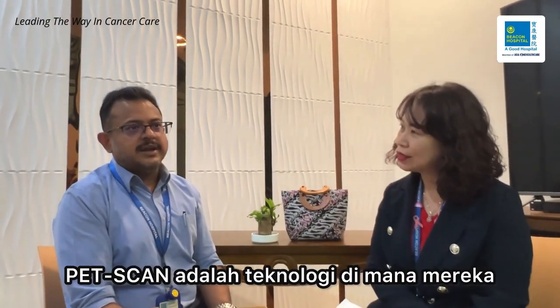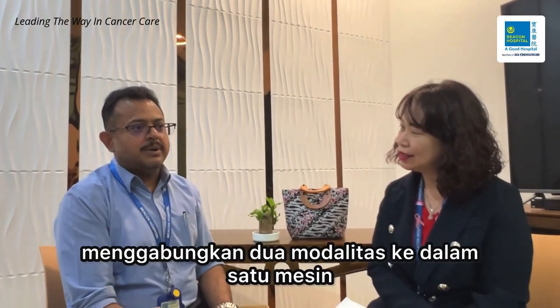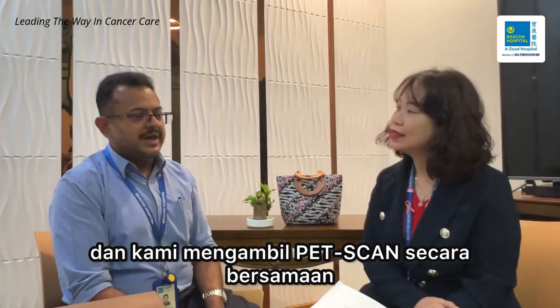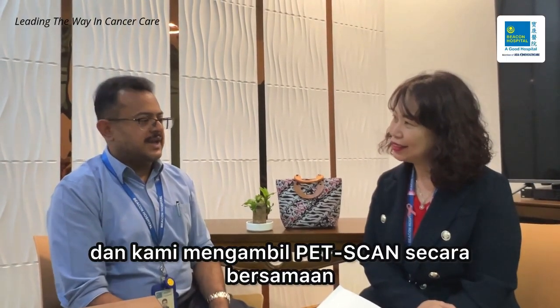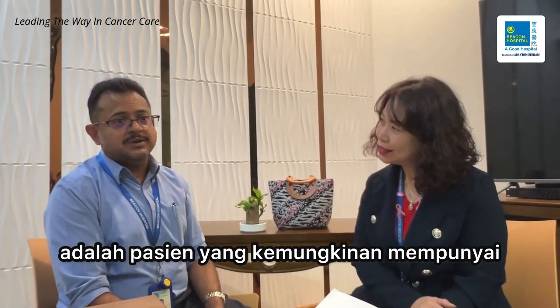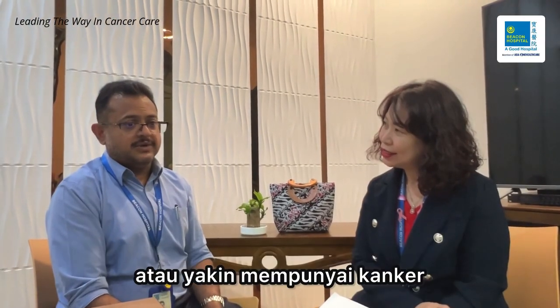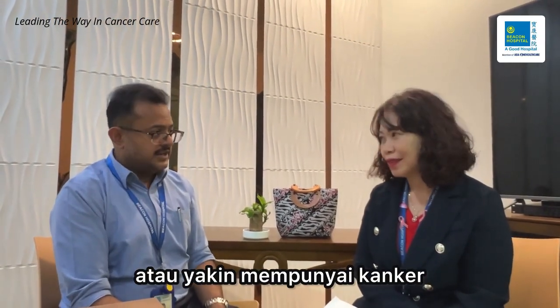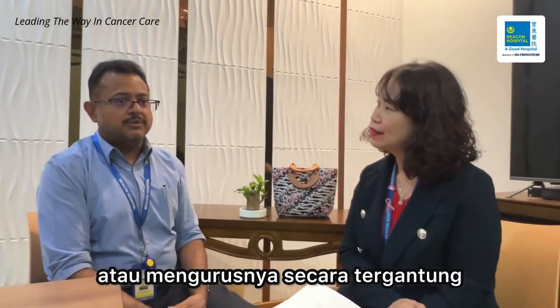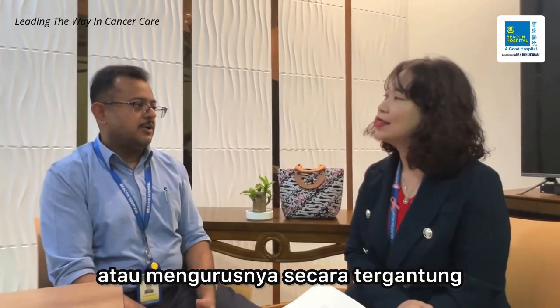So PET scan is a technology where they combine two modalities into one machine, and we acquire the scan simultaneously. The patients who require PET scans are usually patients that we suspect to have cancer or confirm to have cancer, so that we know how to manage or treat them accordingly.